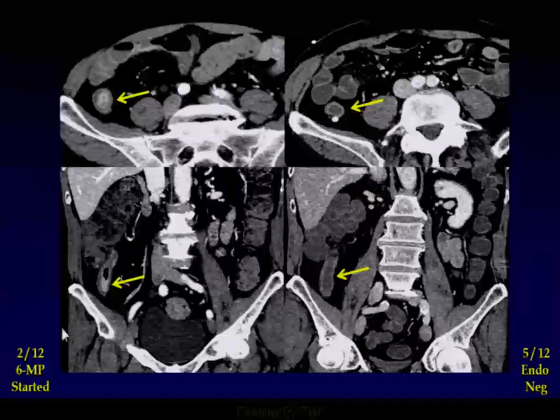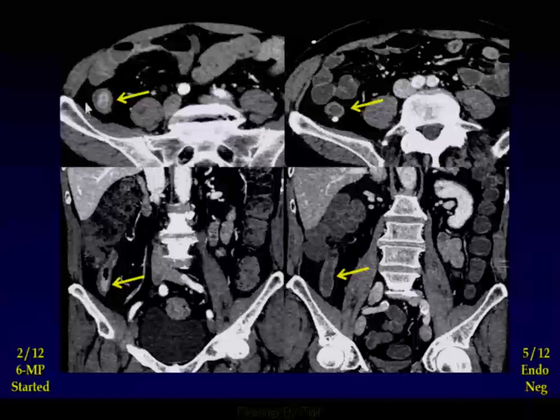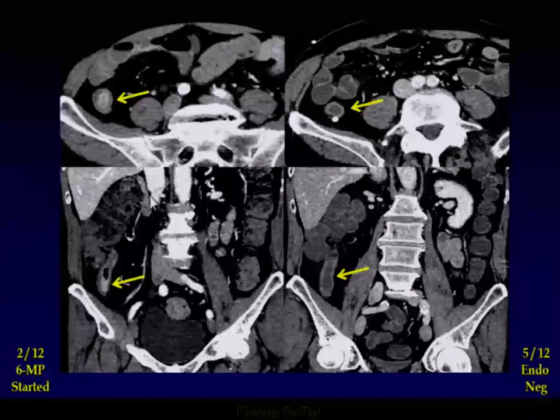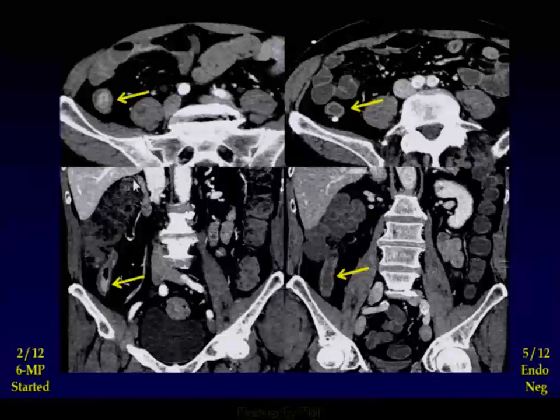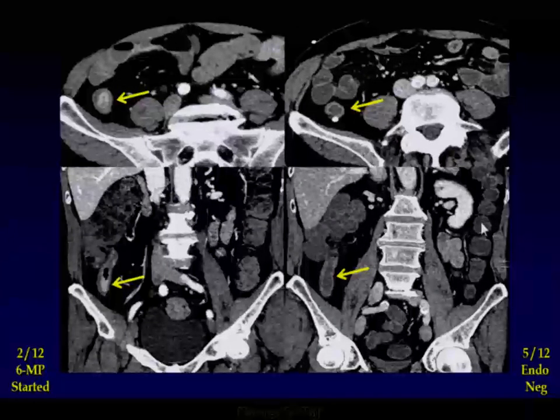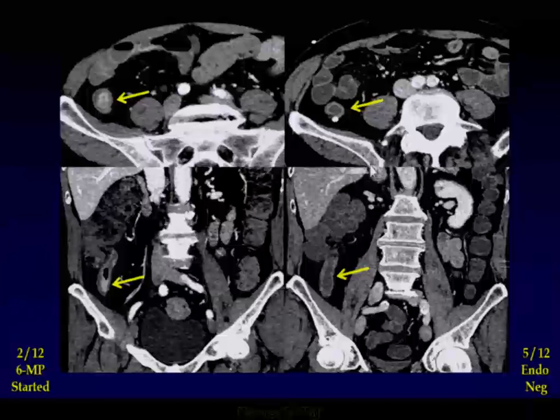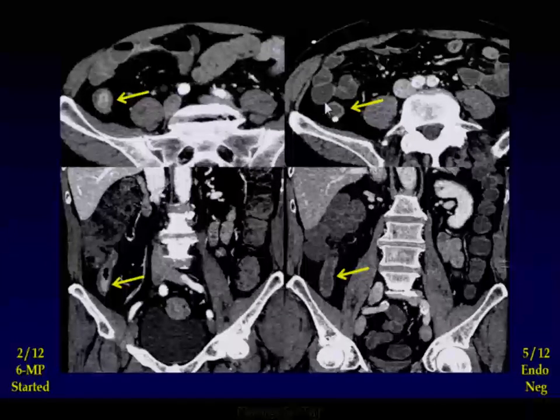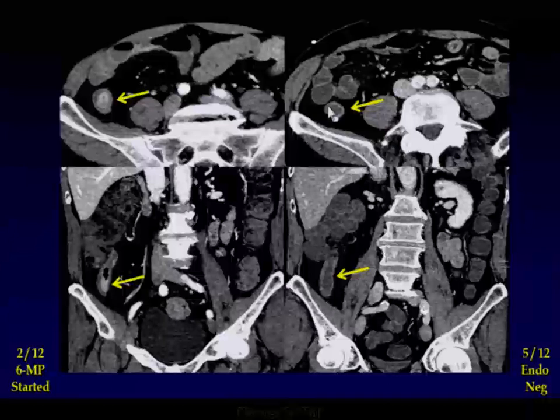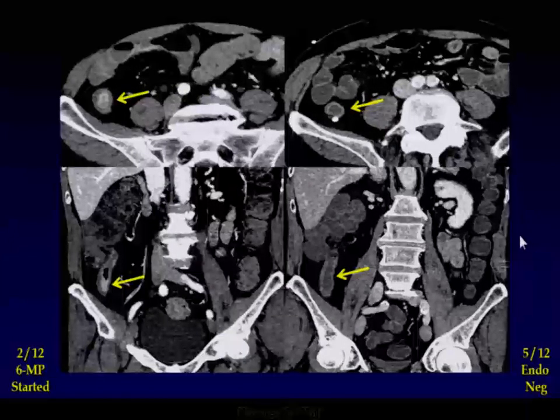Here's an example. In February 2012 we have active disease with luminal narrowing but without upstream dilation right here in the terminal ileum. After three months of medical therapy with 6MP, we can see just very minimal hyperenhancement and some wall thickening. This is inactive Crohn's disease.